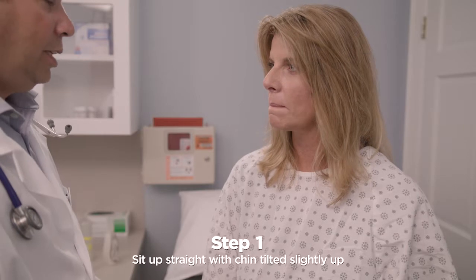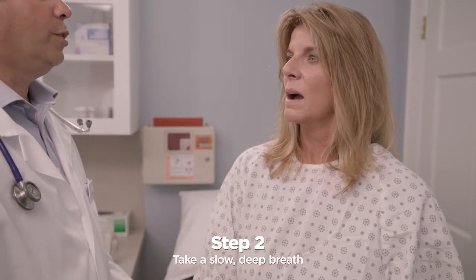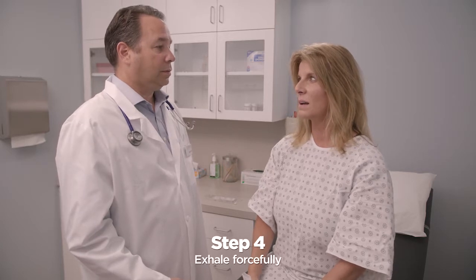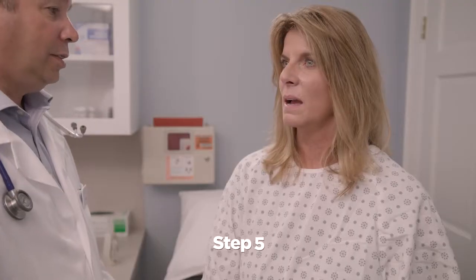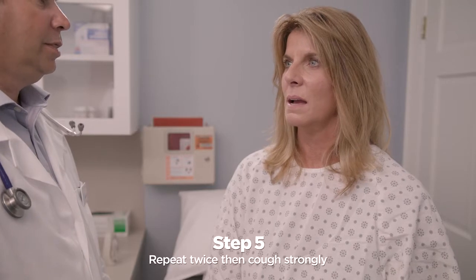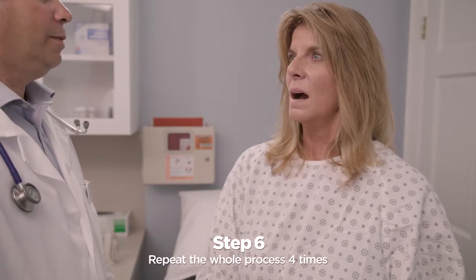Sit up straight with chin tilted slightly up and mouth open. Take a slow, deep breath to fill lungs about three quarters full. Hold breath for two or three seconds. Exhale forcefully in a continuous exhalation to move mucus from the smaller to the larger airways. Huffing is like exhaling onto a mirror or window to steam it up. Repeat this maneuver two more times and then follow with one strong cough to clear mucus from the larger airways. Now repeat breathing and huff coughing four times, or as directed by your healthcare practitioner.